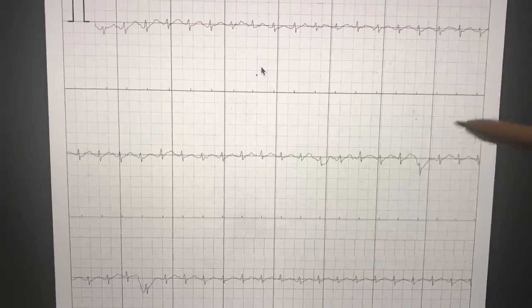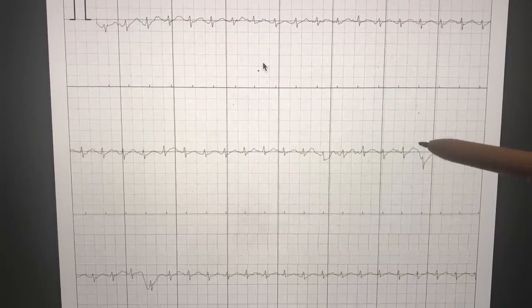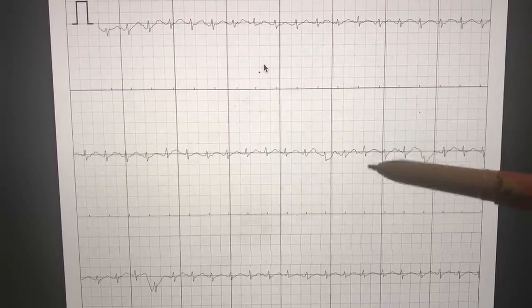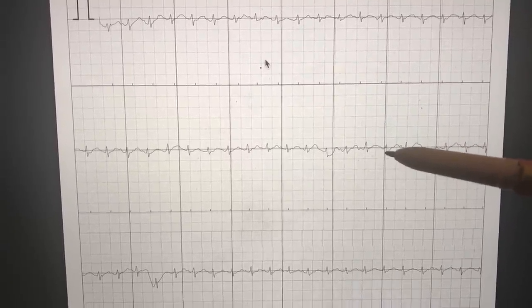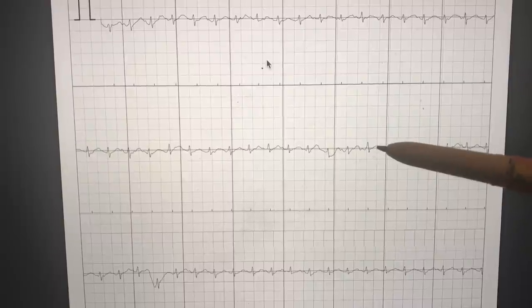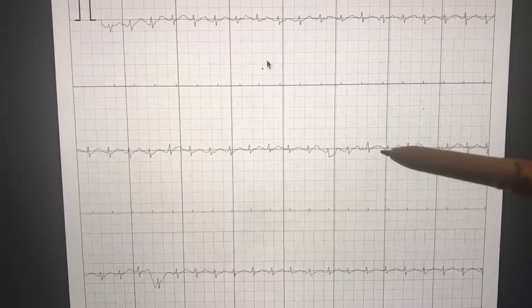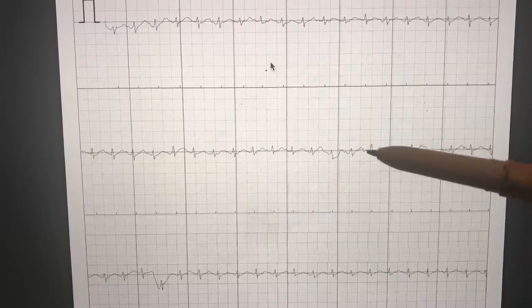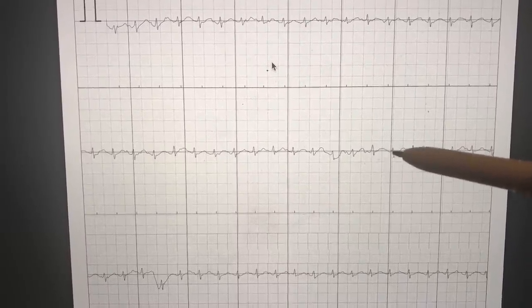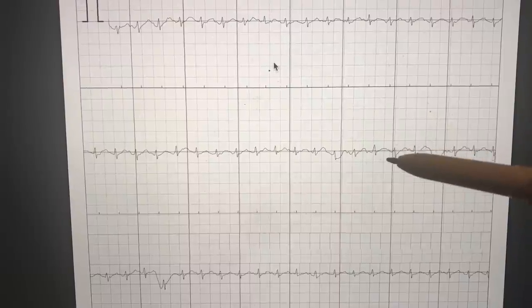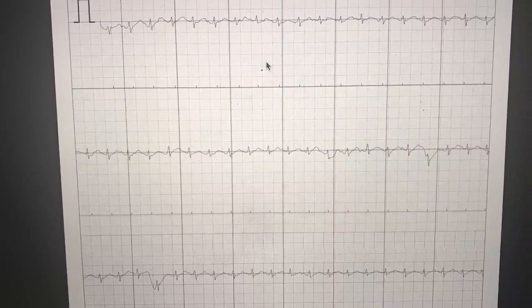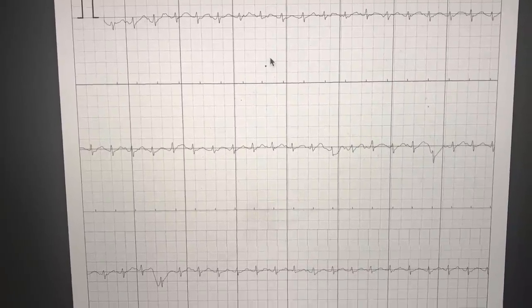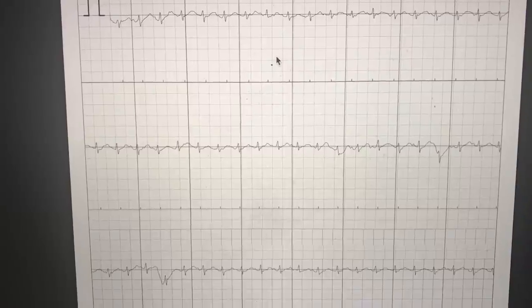Number one, it's worth remembering that the way you calculate the rate is to count the number of big squares between two spikes and divide 300 by that number. So here there are two big squares between these two spikes, so 300 divided by two tells you the heart rate is 150. If there were four big squares between the two spikes, the heart rate would be 75. That's how you calculate the heart rate.